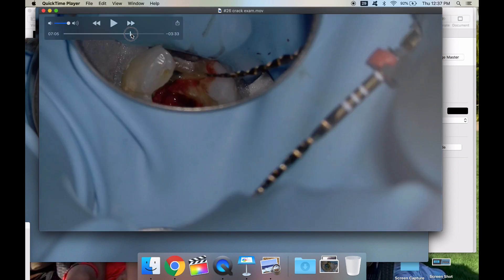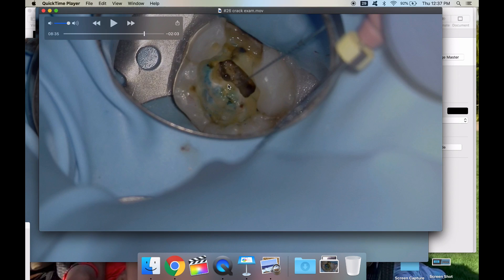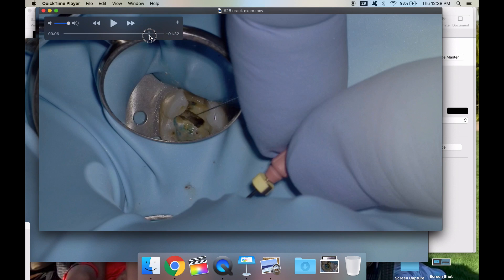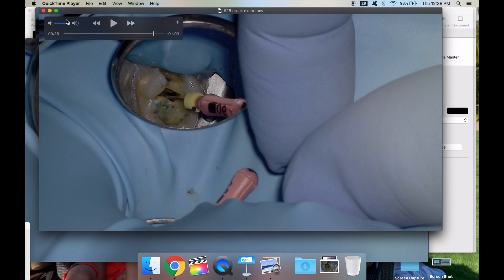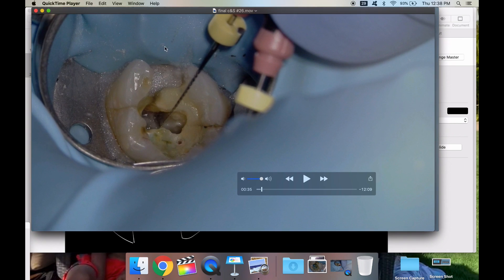We're going to do that to all the canals, rinse it out. We've got a little pulp tissue remaining — we've got our mesiobuccal canal, distalbuccal canal, and the palatal canal. I'm going to take a number six file and start getting to length. There's actually an apical calcification or apical curve on this, and getting around that is a secret I'll talk about later.